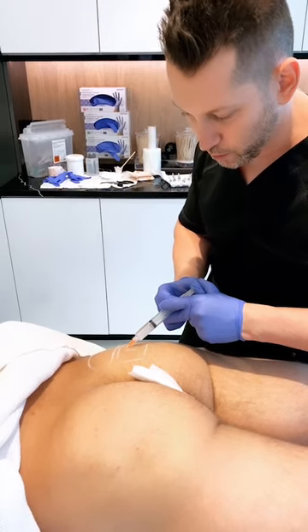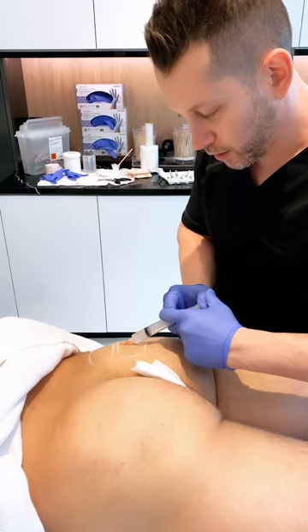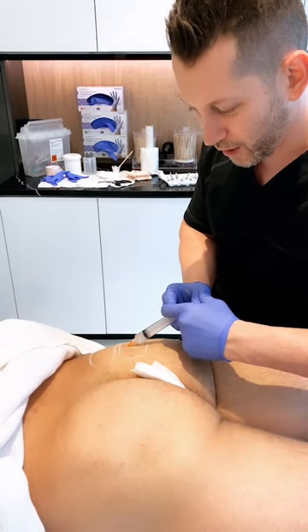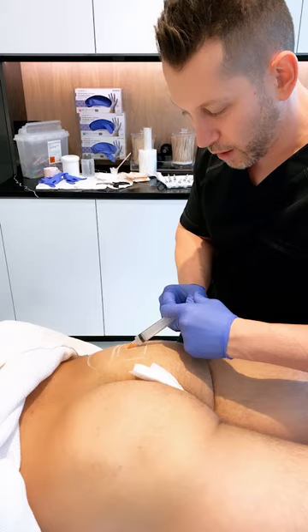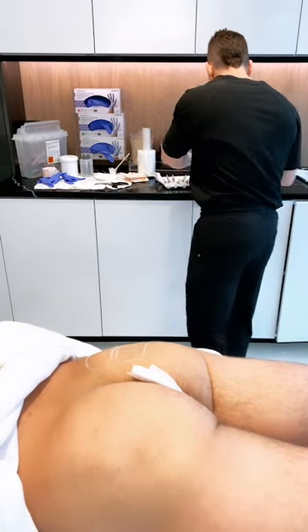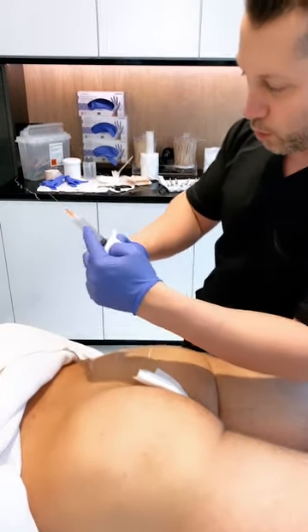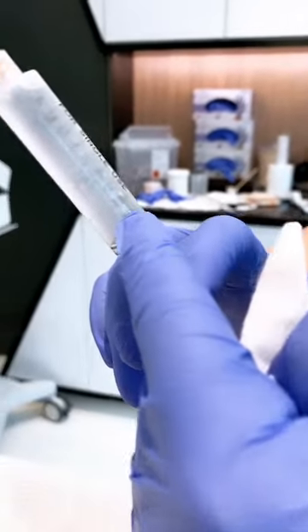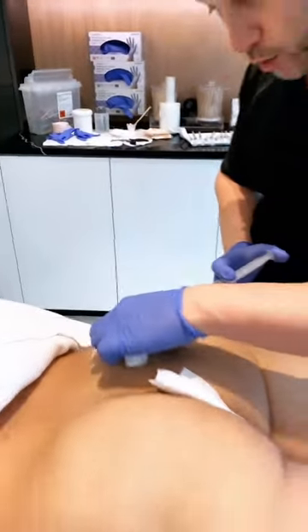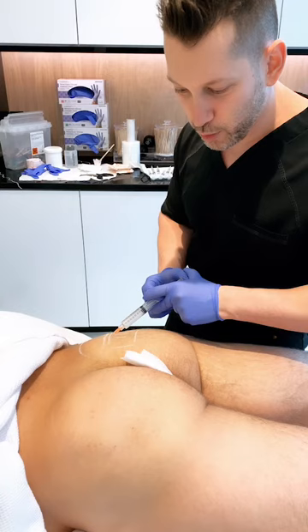It's a little hard for some guys who are really lean and athletic to have as much perkiness as they might want, because they don't have a lot of fat. So unless they do a lipo and try to get the fat, we don't have it. Somebody that works out a lot can do Sculptra, which is little crystals, you can see them inside the fluid, made of a particle that's actually a suture material. And the suture material then builds over time.